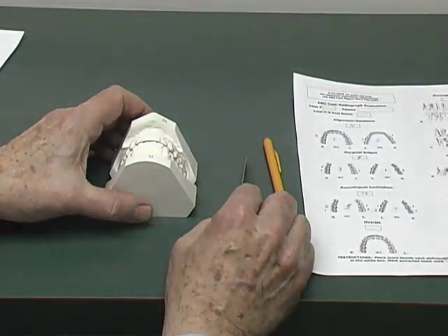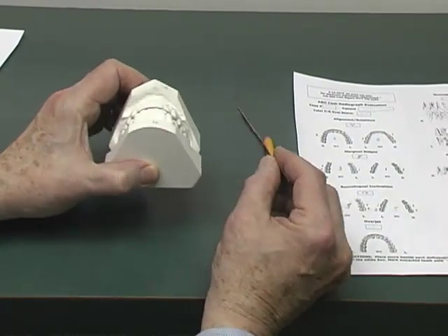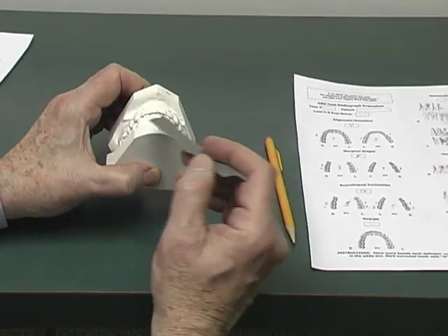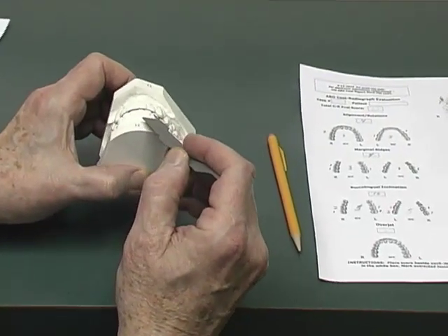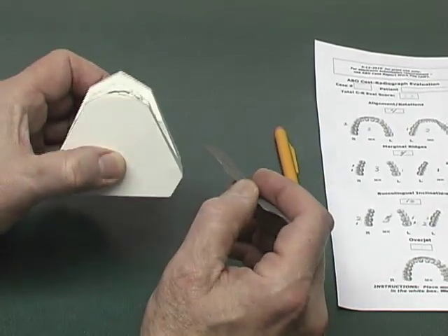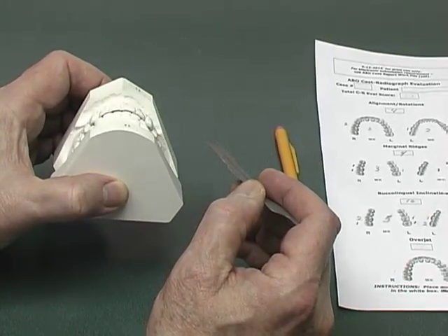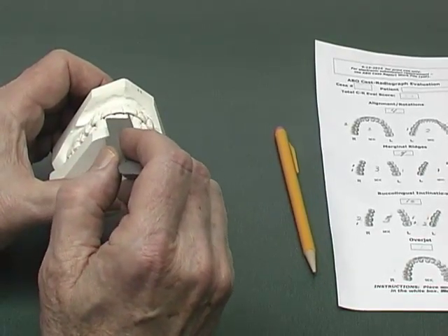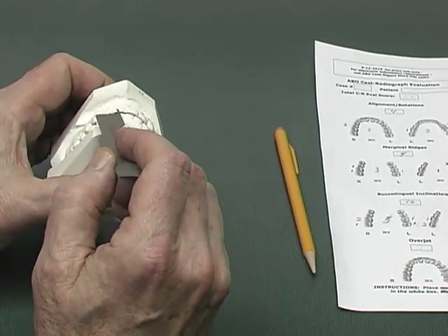Here are the casts, occluded. I'm going to pick them up after I've made certain they are occluded on their backs. I begin usually with the anterior teeth — the edges of the mandibular teeth should contact the lingual surfaces of the maxillary teeth. I will visualize and evaluate to see if they appear in contact, oftentimes using the half millimeter thickness of the measurement gauge. If it won't go through, then I don't score.